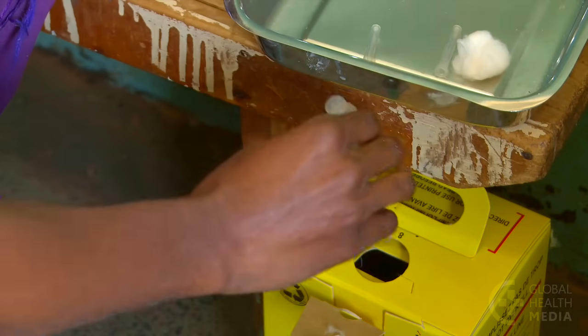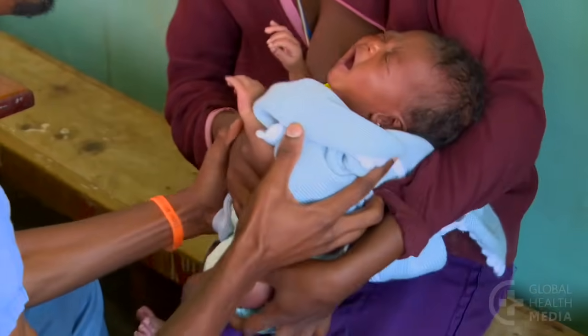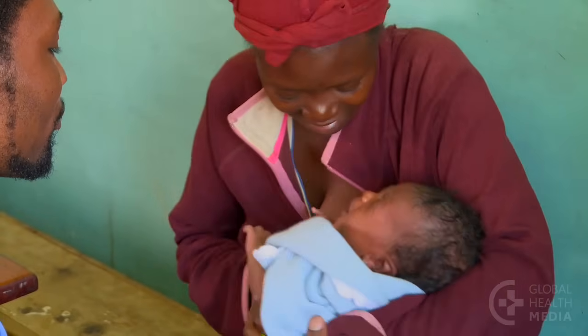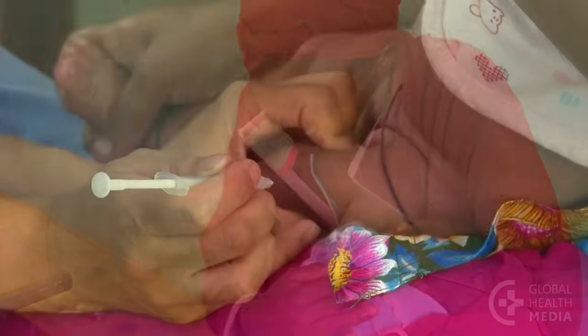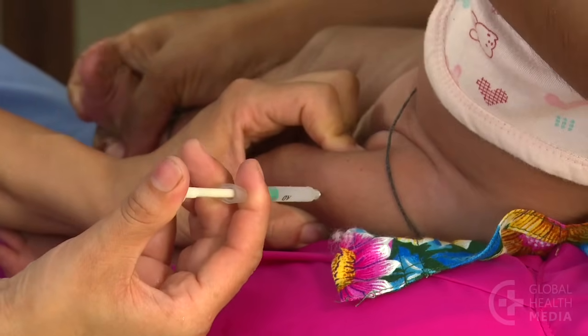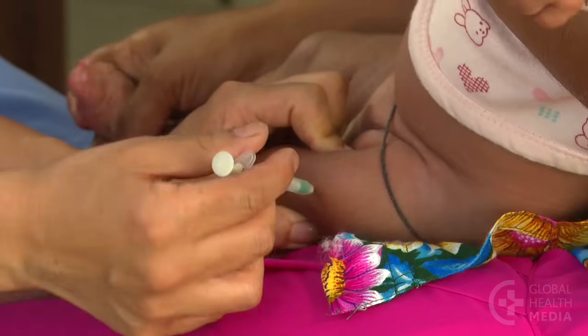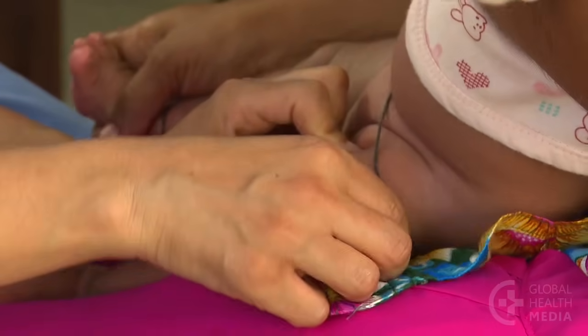Withdraw the needle and apply gentle pressure with a cotton ball. The needle goes safely into the sharps container. Current guidelines advise it is safe to inject without drawing back on the syringe to check for blood, since there are no major blood vessels in the outer thigh of a baby.